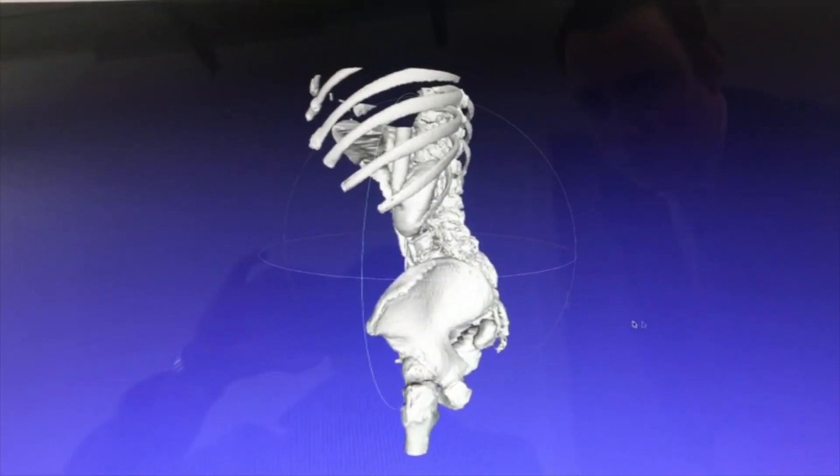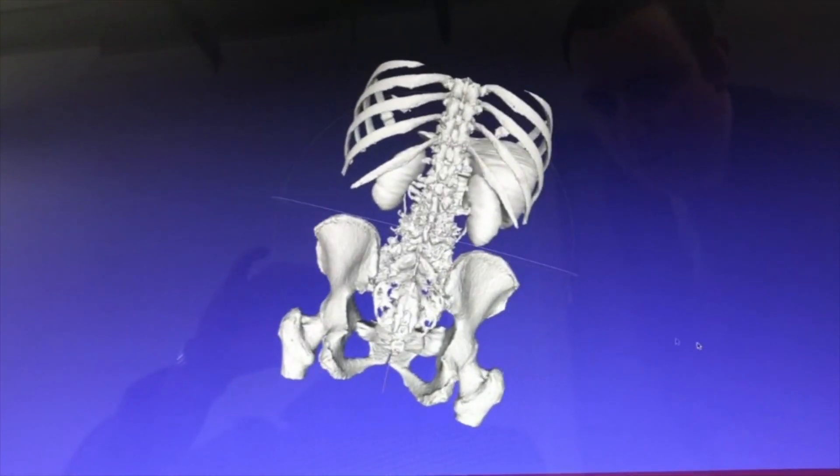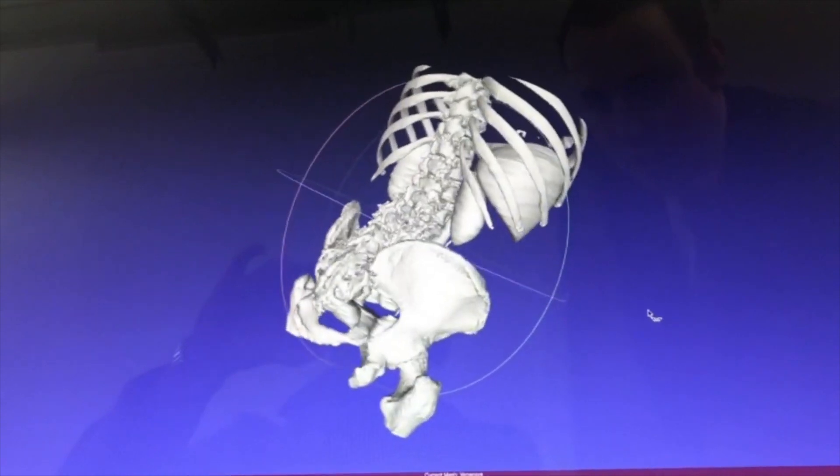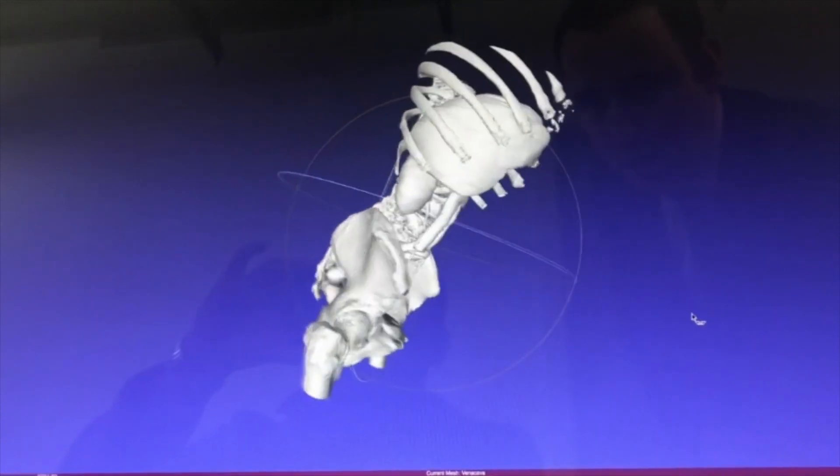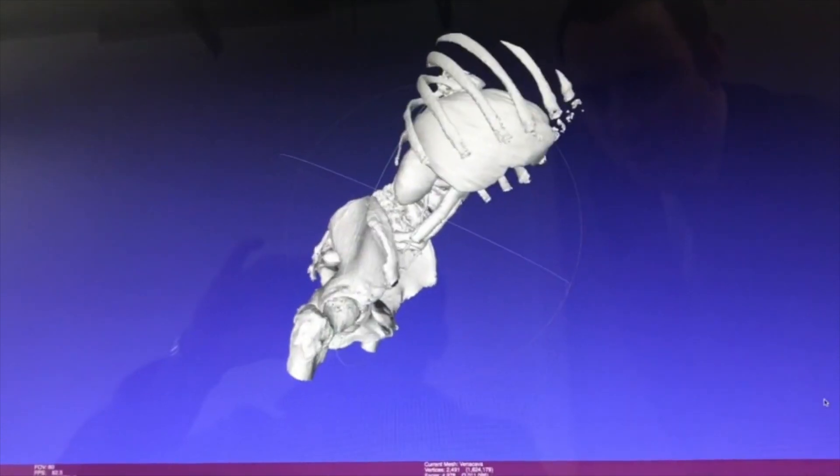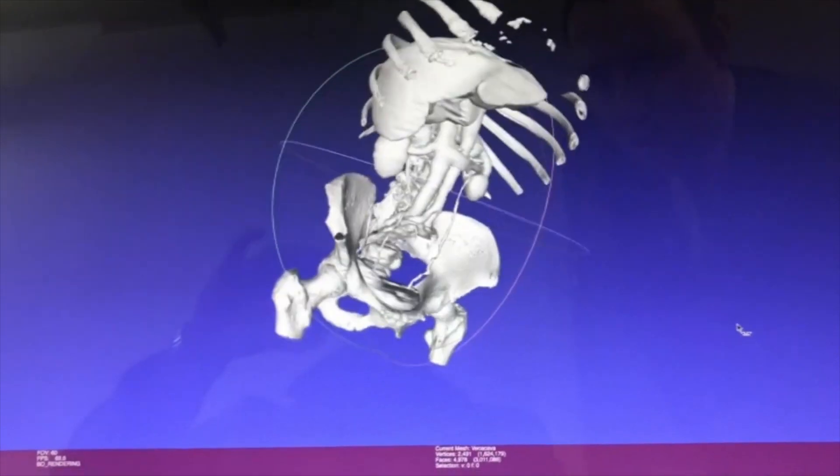This highly realistic model, once loaded onto the viewing device, can be displayed in augmented reality.